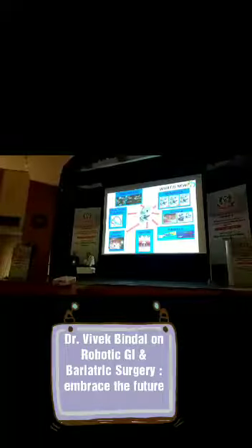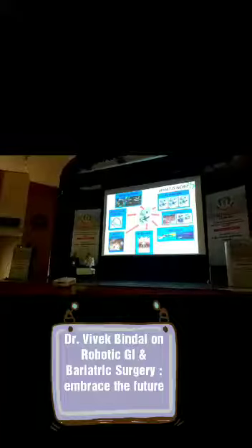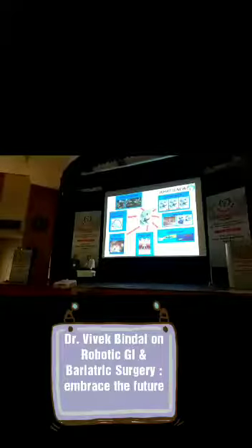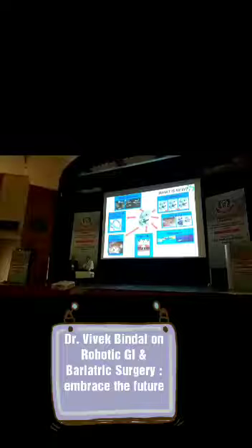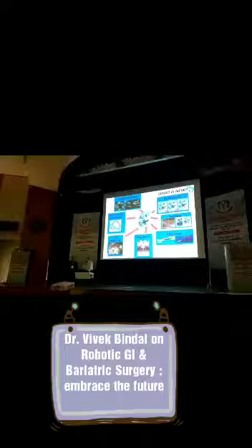If I am going to cut common bile duct in a laparoscopic cholecystectomy or robotic cholecystectomy, it is going to tell us, no, you are going to cut CBD, stop. So there is a warning message, and this is real, this is not future, this is present. There are warning systems, there is GPS of surgery, there is artificial intelligence coming up, which would guide the surgeon. You are going to divide pulmonary artery, just be careful. And if you want to go ahead, you can definitely overcome that warning, but at least you get a warning.